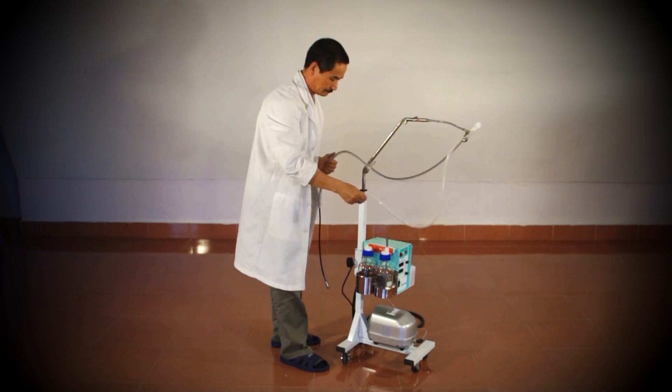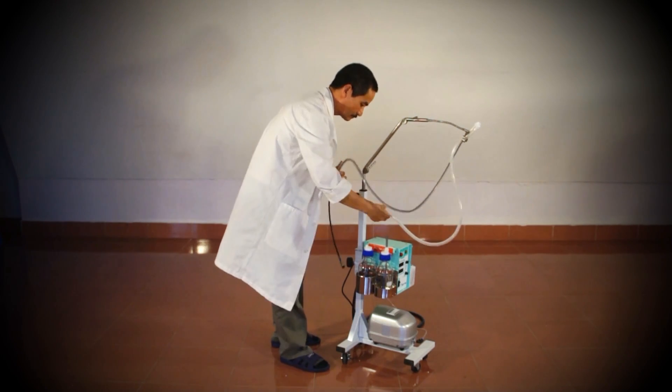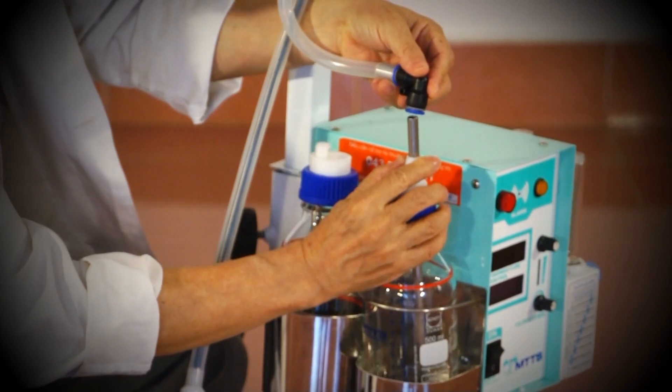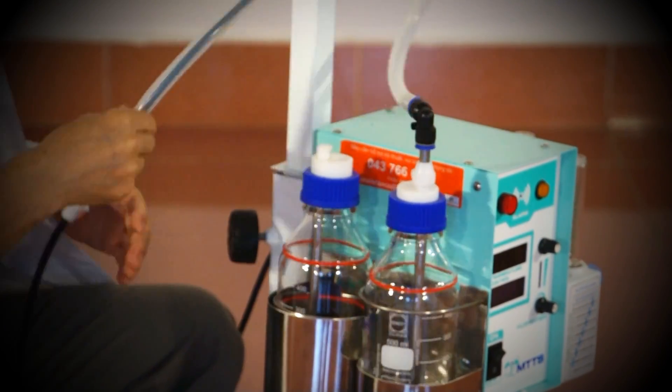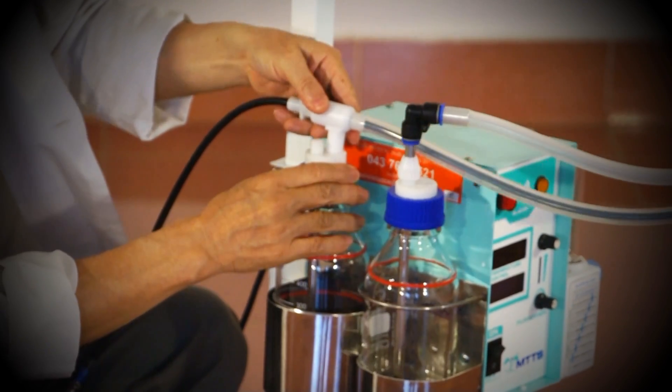Then connect each tube to its appropriate bottle. The tube is attached to the PEEP bottle. The tube with the heater wire is attached to the humidifier bottle.